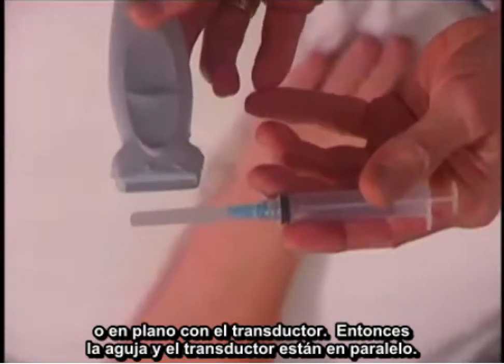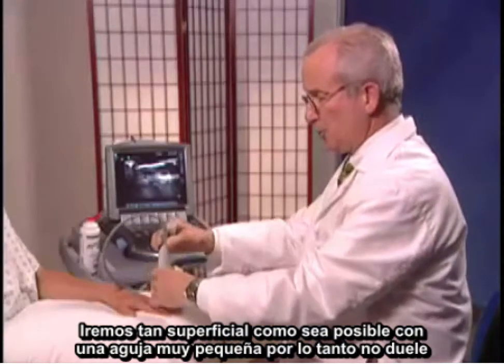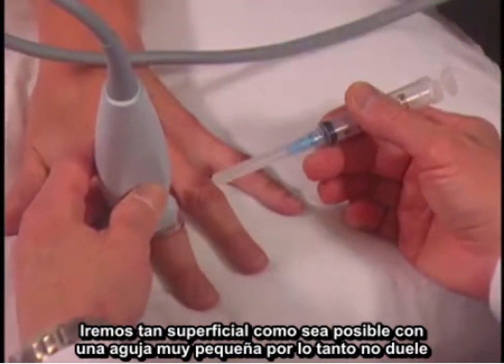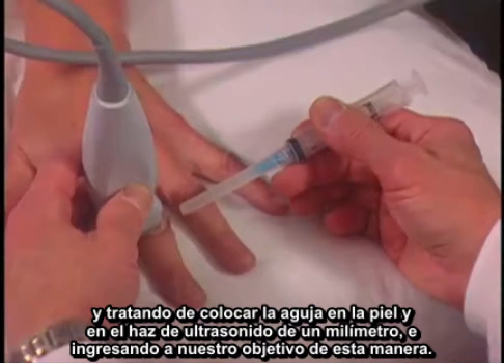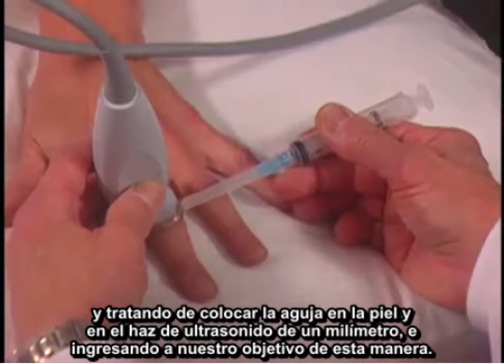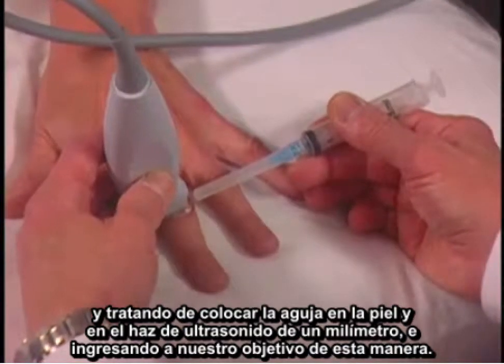So my needle and my transducer are parallel, and I'm going as superficial as possible with a very small needle so it doesn't hurt, trying to place the needle into the skin and in the one millimeter ultrasound beam into the target this way.